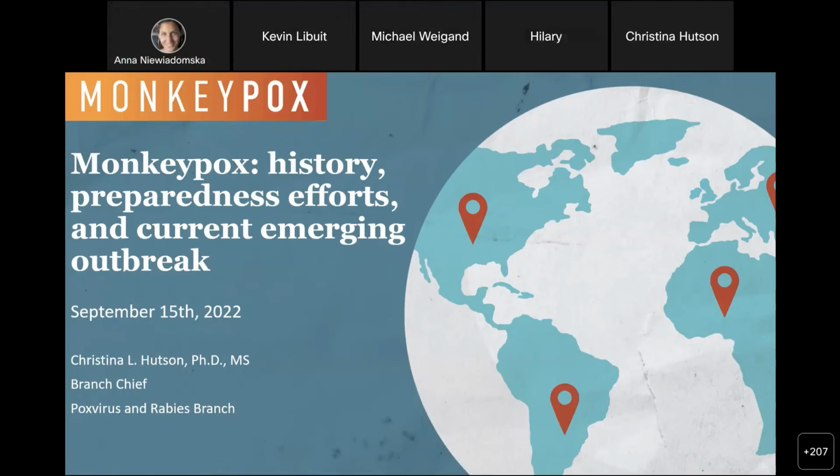Dr. Lee et al. did develop these targets within our monkeypox GeneXpert, and so that is actually already published. They took this into DRC and validated it with skin lesion material from monkeypox infected individuals, and it worked very well. It was compared to the real-time PCR tests. This has both an orthopox generic as well as a monkeypox specific target, which is nice for us because, for smallpox, we want to be able to differentiate a smallpox case from a monkeypox case, and this would help us to do so.